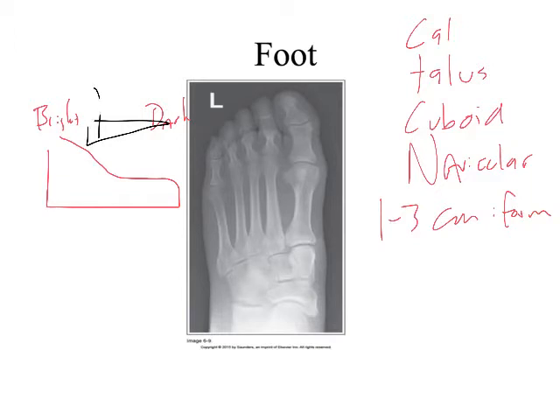Sorry. It's late in the afternoon, I guess. Like this, right? We would want the remnant beam to receive less filtration right here because the image is bright over here, right? And more filtration on this side because the image is dark over here, right? That would be a compensating filter, a wedge filter, okay?